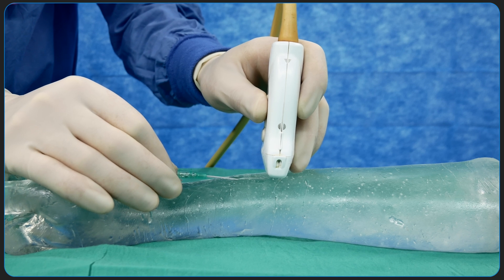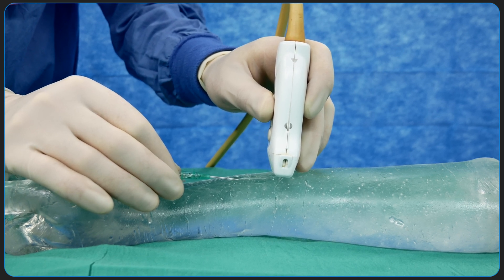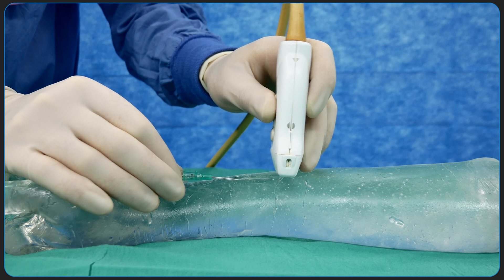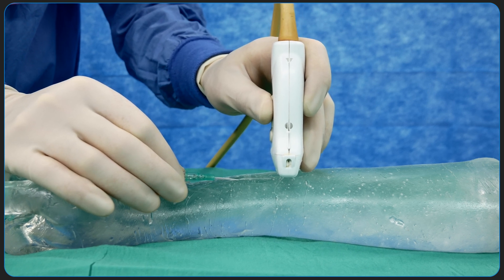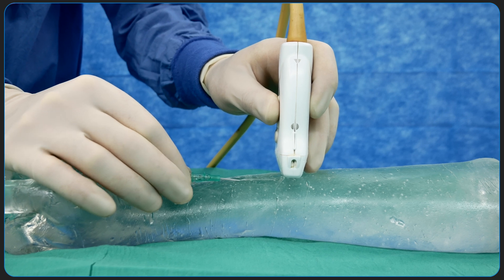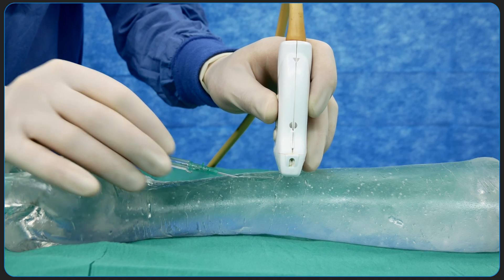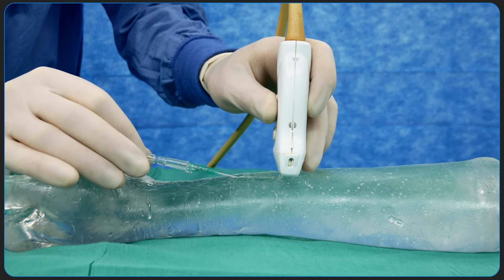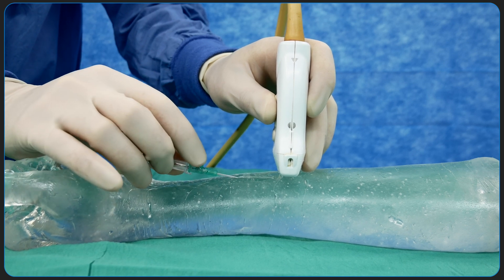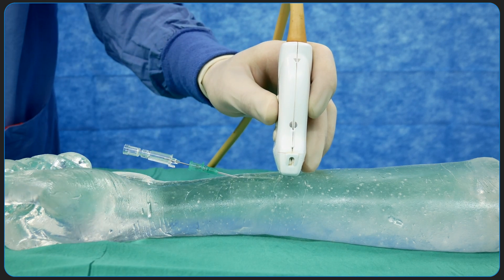After the tip of the bevel is identified on ultrasound, the angiocath is advanced until the ultrasound beam cuts through the body of the bevel. The probe is translated proximally to visualize the tip of the bevel again. This process may then be repeated until at least two-thirds of or the entire angiocatheter is in the vessel. Prior to advancement of the catheter over the needle itself, a subtle sideways wiggle without advancing may help ensure that the tip of the bevel is free and not snagged on a wall.